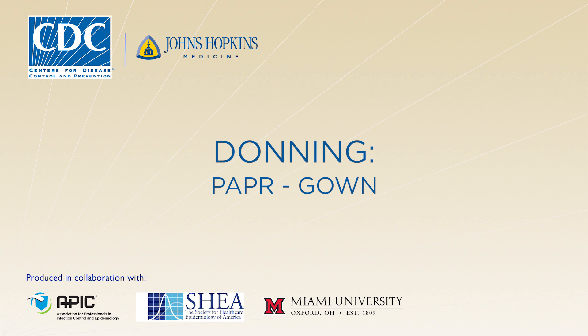This donning procedure assumes the facility has elected to use a powered air purifying respirator, or PAPR, and a gown. An established protocol facilitates training and compliance. Use a trained observer to verify successful compliance with the protocol. The trained observer will read aloud each step in the donning procedural checklist and visually confirm and document that the step has been completed correctly.